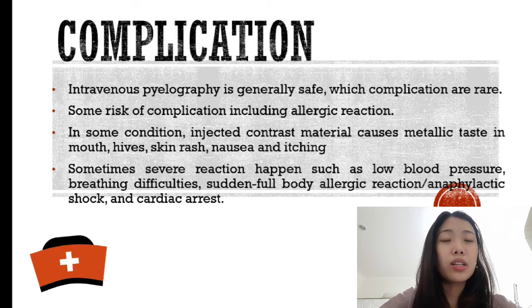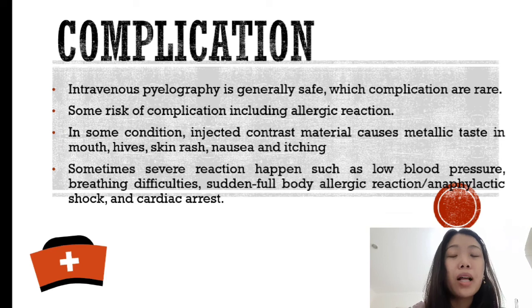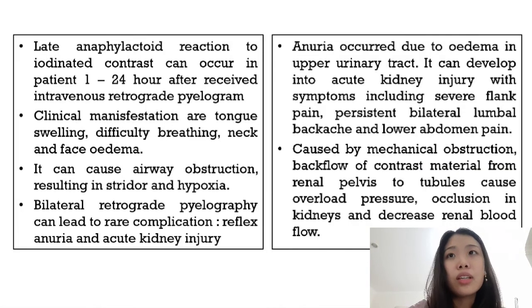Intravenous pyelography is generally safe, and complications are rare, but there are some risks of complications such as allergic reaction. In some conditions, injected contrast material can cause metallic taste in the mouth, hives, skin rash, nausea, and itching. Sometimes severe reactions happen such as low blood pressure, breathing difficulty, sudden full body allergic reaction or anaphylactic shock, and even worse, cardiac arrest.